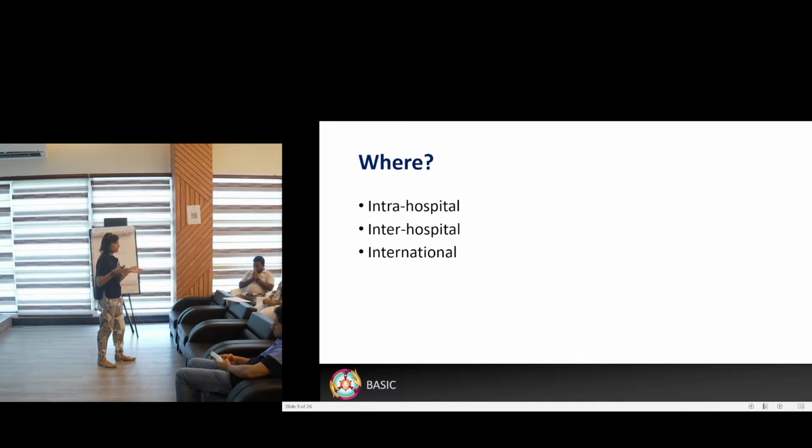I ideally like my patient on a portable ventilator for at least half an hour while I'm setting everything up, so that I know they have tolerated that ventilator, which is not your nice ICU ventilator, it's a more basic one, and they've not deteriorated, yeah? So if I'm happy their ventilation's not changed on the portable one, I'm ready to go, yeah? I quickly call the CT scanner, they're happy, they're ready for me, and we go.